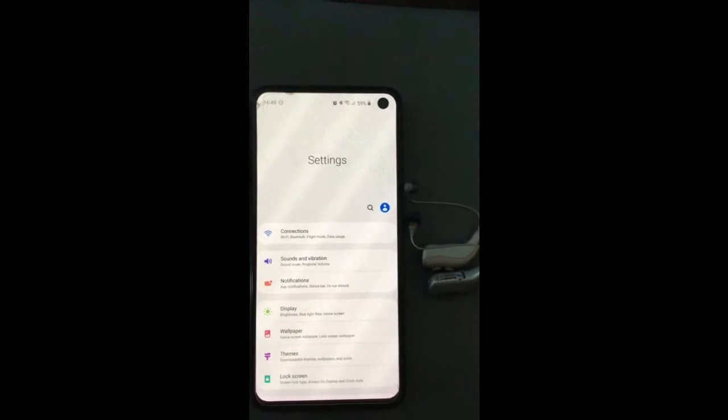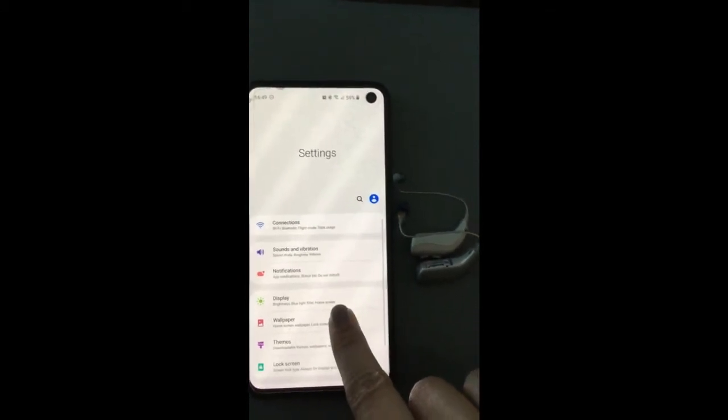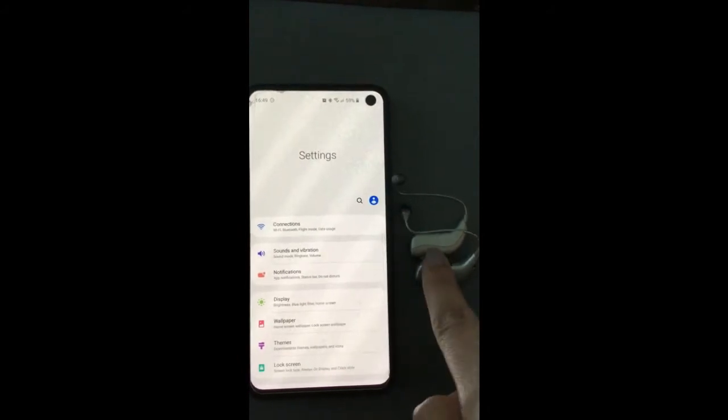Hi, welcome to Brigitte Harley Hearing Care Limited. Today I'm going to show you how to connect your Android phone to your Burnathon Viron hearing aids.